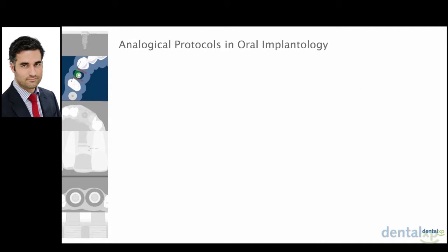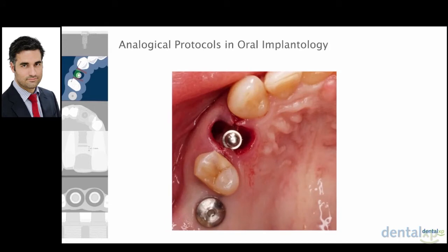She accepted. We go with the surgery. Of course, there is something that has to be always present: biology is the same although the years are passing by. So if you are placing an implant, you have to place it in a correct 3D position, because this is very important if you want to achieve a predictable and aesthetic result.